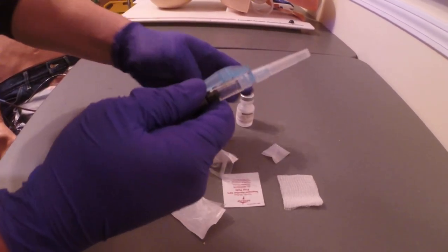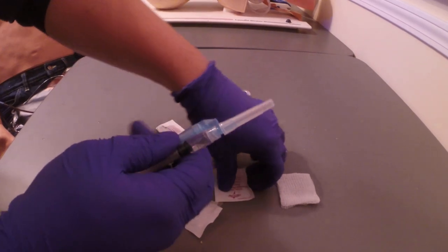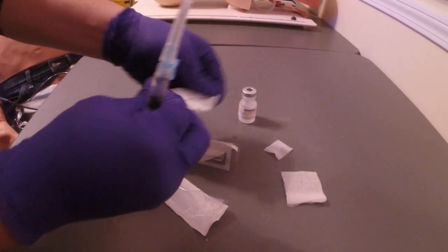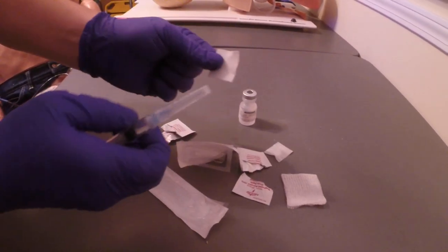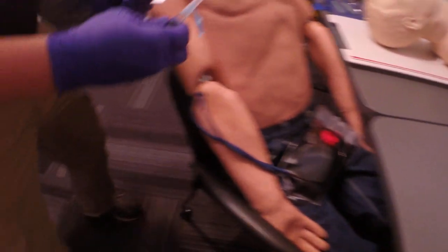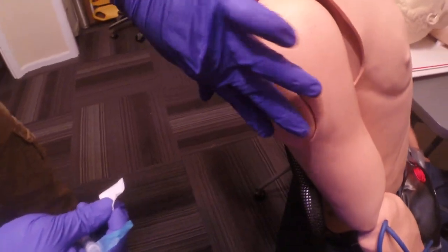Push your safety cap to the side. Take your alcohol prep, we're going to prep our site. It's going to be our deltoid muscle.